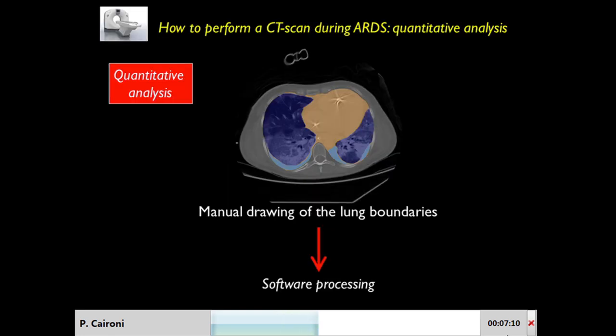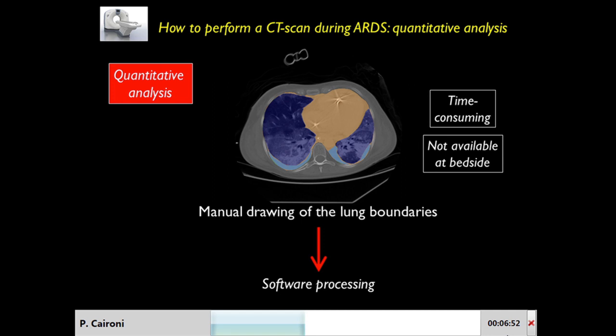I would say no, because so far we need hands to draw the lung boundaries. We need a specific software to arrive at the quantitative analysis of CT scanning, and we need time. So this is a time-consuming technique not available at the moment at the bedside. And we also need to transfer the patient to a CT scan facility.